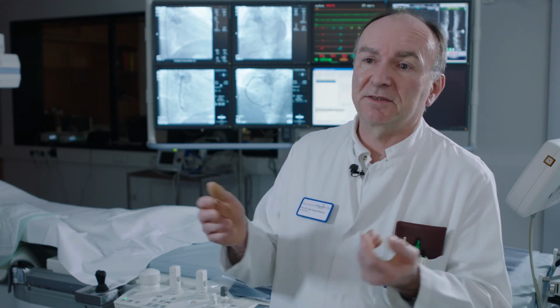IVUS is a device that you use in the beginning of the procedure, in the middle, at the end. So it should be a stable catheter. The imaging quality should be stable, and I think that electronic probes are superior to mechanical probes in this situation, because in the mechanical probe, and I worked for many years, I started with mechanical probes, you will have the air bubble obstruction of the image, and then you will have to work again getting the catheter air-free. So that's a hassle that you want to avoid in a CTO procedure, which is complex anyway.